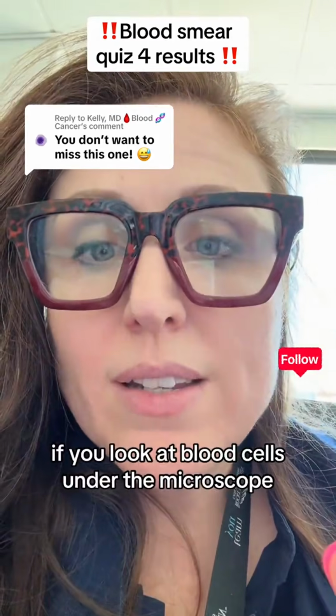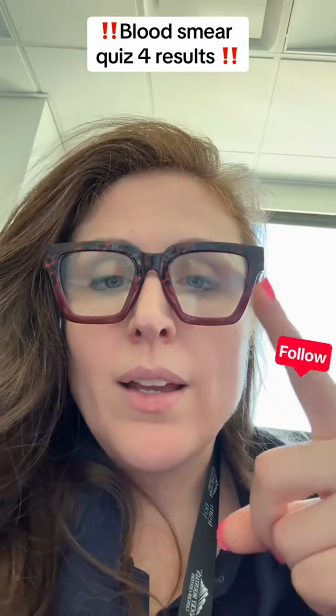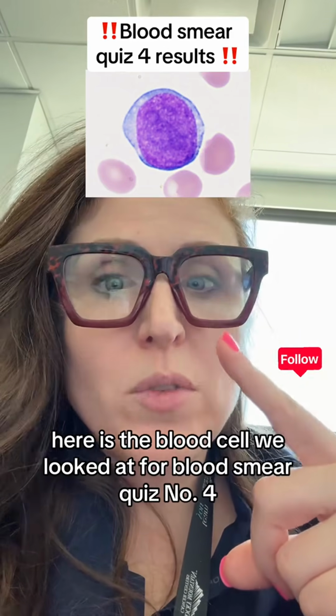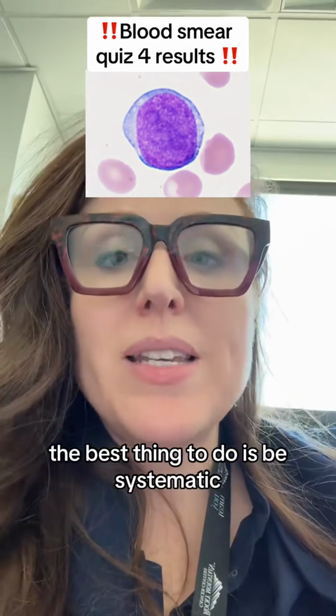If you look at blood cells under the microscope, this is a cell you don't want to miss. Here is the blood cell we looked at for blood smear quiz number 4. When you're learning to read blood smears, the best thing to do is be systematic.